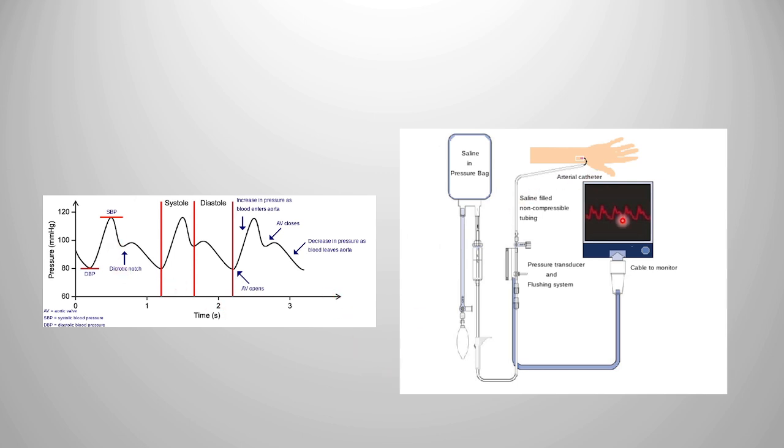What happens is that there is a natural frequency in the arterial blood pressure system, and when you transduce the system, put a catheter, the frequency of our whole system, the tubing and the connections, should be at least 7 to 8 times the natural frequency of the arterial system. Otherwise all the frequencies will resonate and you will not get good readings. We'll come to how the pressure transducer works.